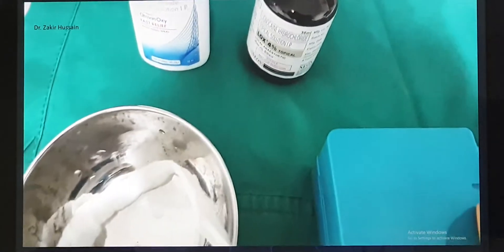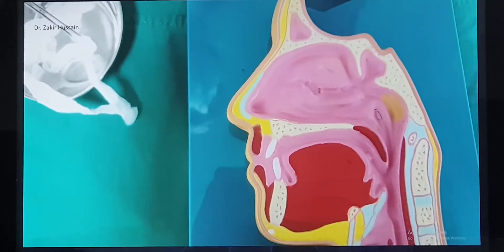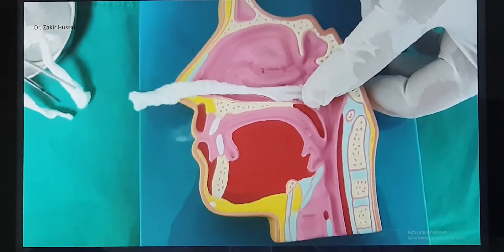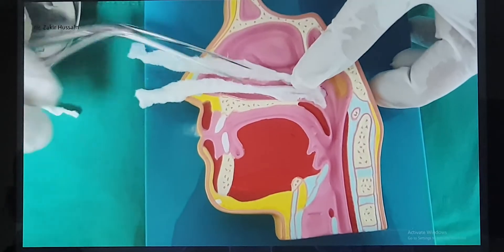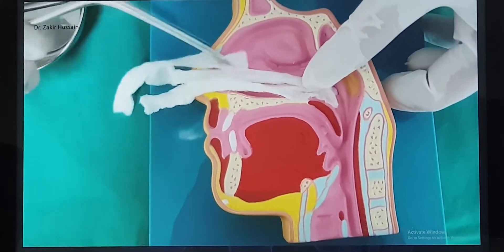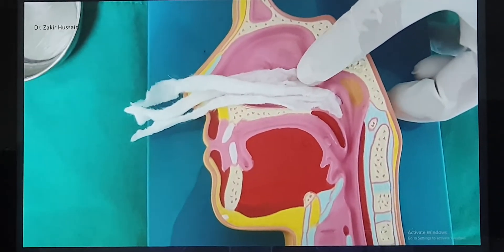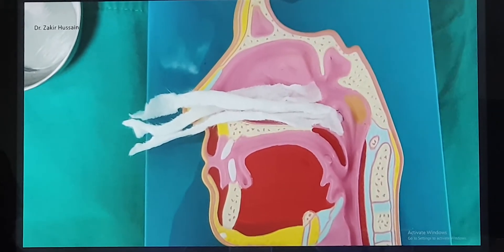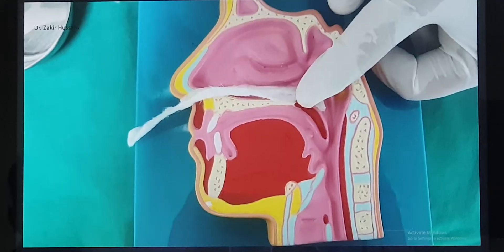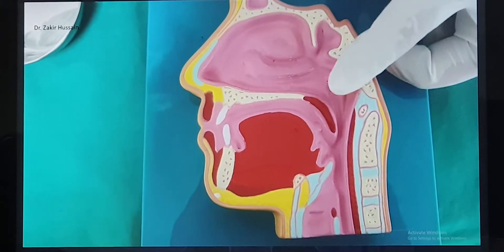Now let me show you how to place it. First we keep nasal packing cotonoids to decongest and anesthetize the nose — the same way as the traditional technique. I am placing the medicated cotonoids: the first one, second one, and third one, followed by removal of the pack. These cotonoids will be there for at least 5 to 10 minutes. After removal, the Merocel or Avalon pack is inserted directly into the nasal cavity, though some prefer to apply antibiotic ointment first since it will stay in for 2 to 3 days.